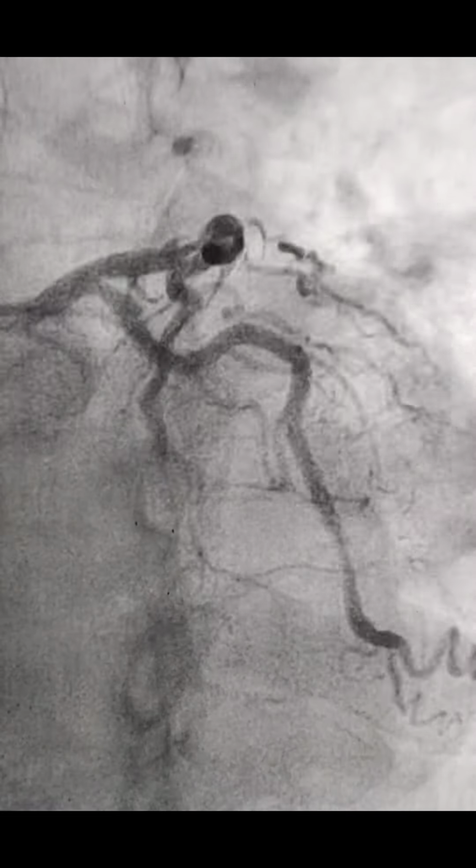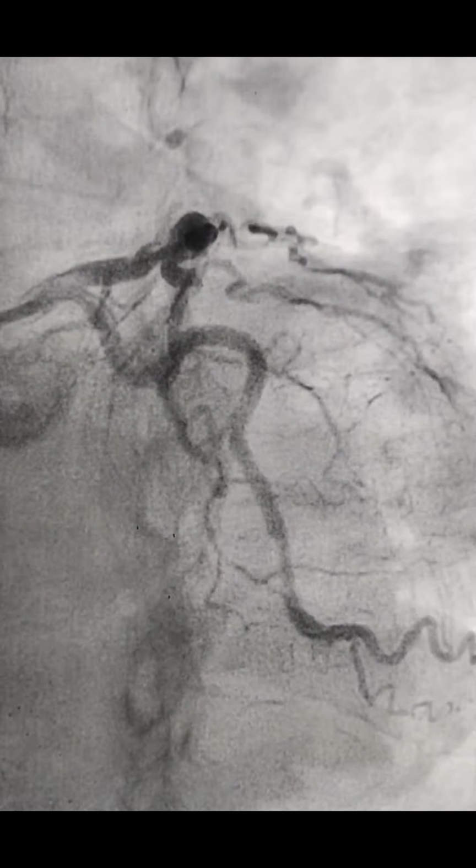This is a 70 year old male, known case of diabetes, hypertension, and ischemic stroke 10 years back. Now presented with CAD, ACS, NSTEMI, troponin T was 30,000, with normal LV function.